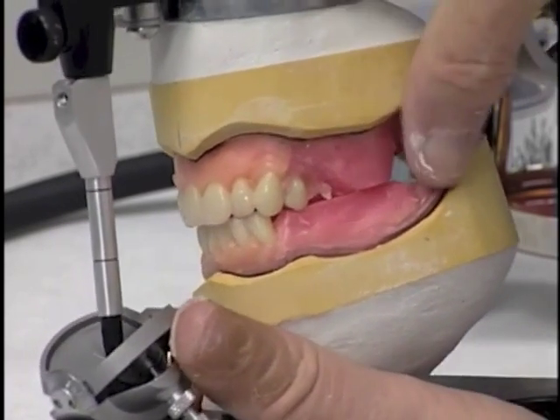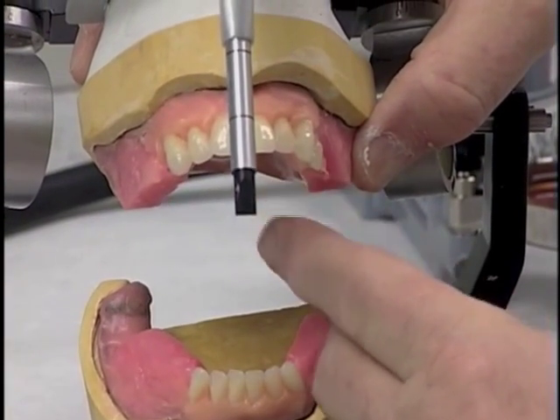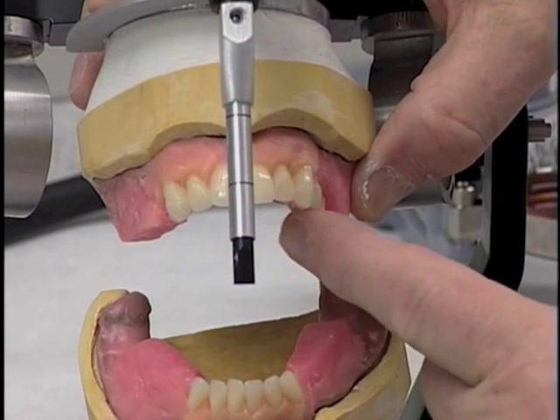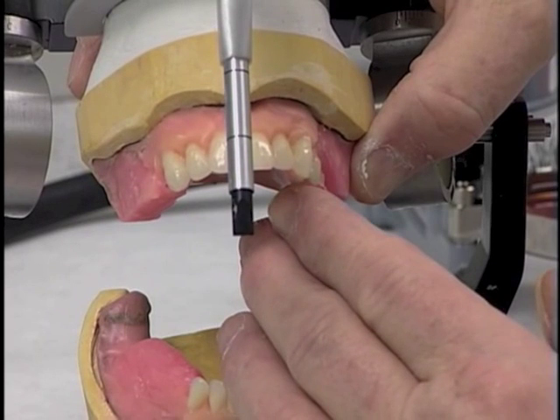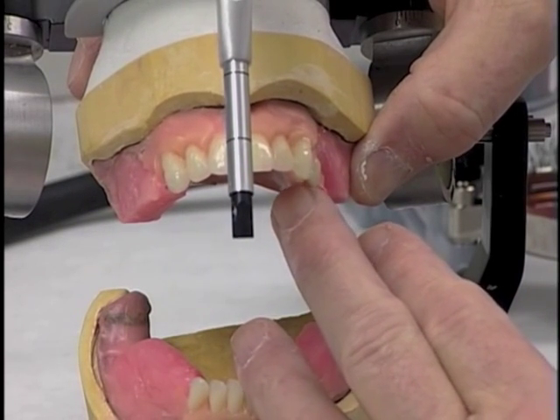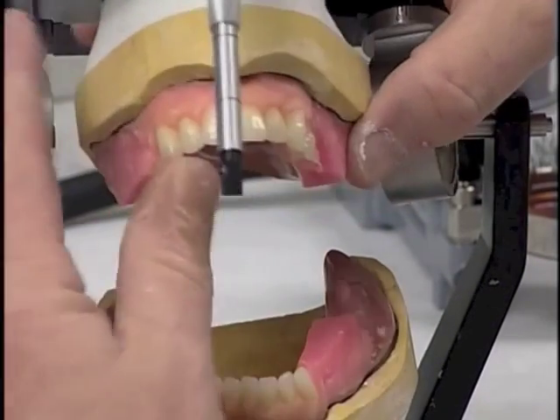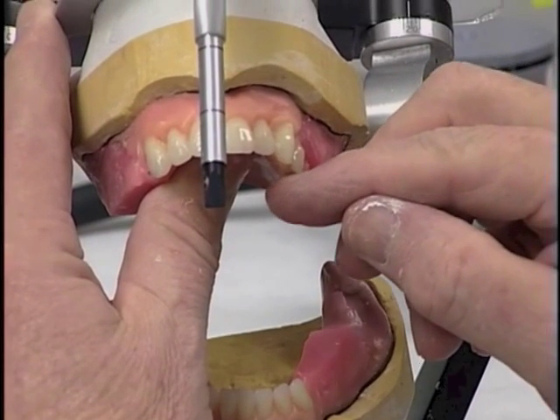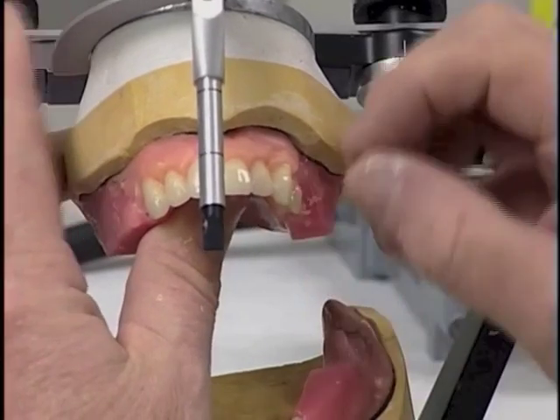One other thing that we would like to observe as we're doing this is to look at the height of the lingual cusp, and it should be, for the maxillary first premolar, virtually the same height as the buccal cusp. It appears as though it's a little higher on the lingual cusp than it is on the buccal cusp, so we would like to twist that tooth like that to raise the buccal cusp just slightly so that that lingual cusp will be at the proper height.